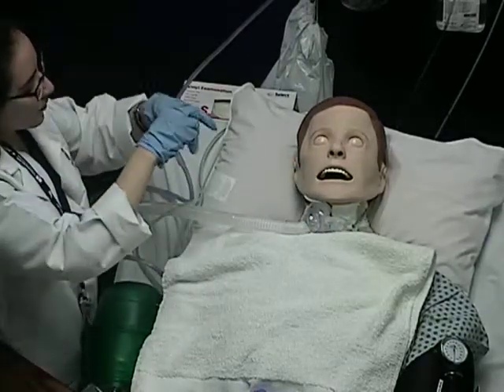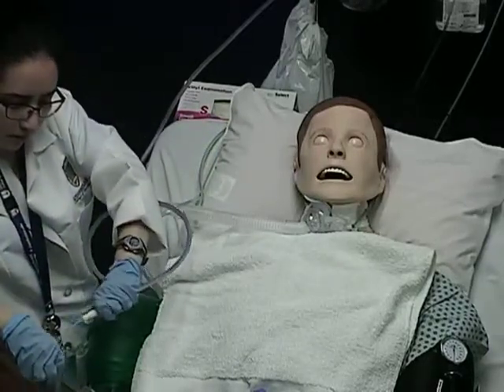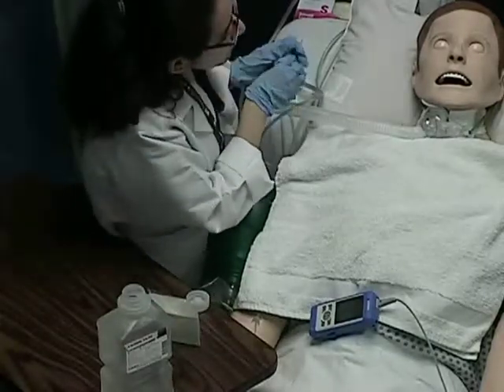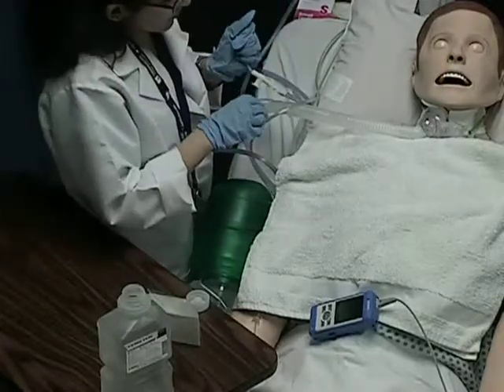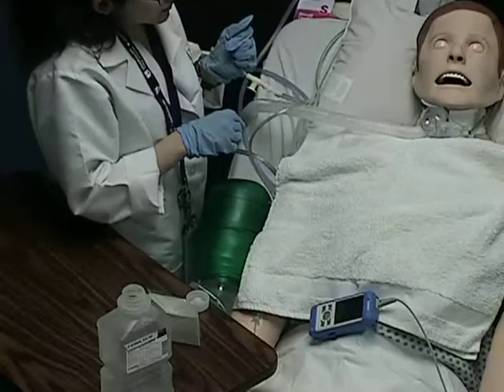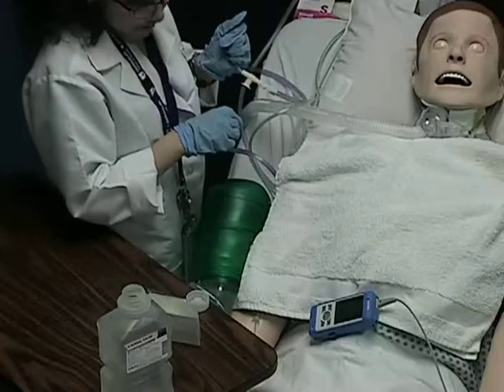and rinse catheter and tubing until clear. Assess patient's cardiopulmonary status for clearance and complications. Repeat steps to clear any other secretions. Allow adequate time between passes, and do not perform more than 2 passes with the catheter. Perform tracheal suction again if necessary.